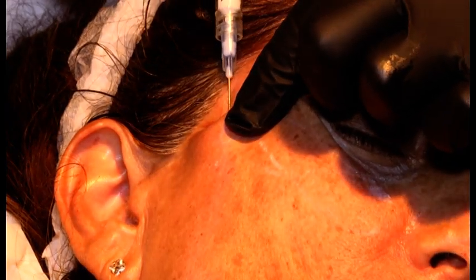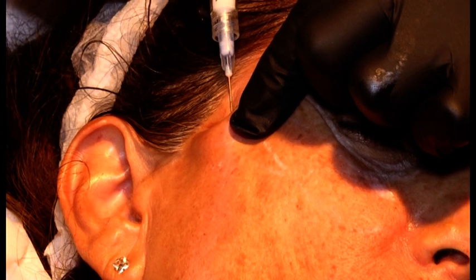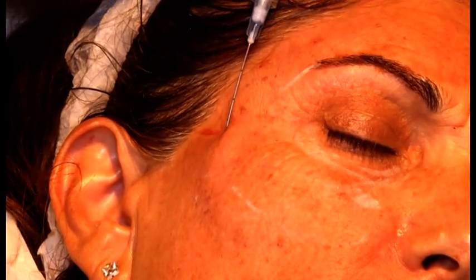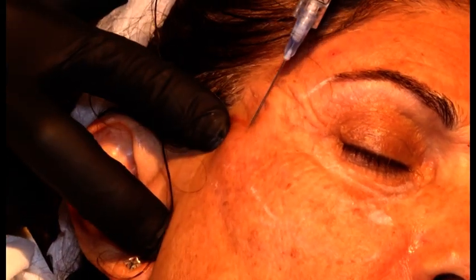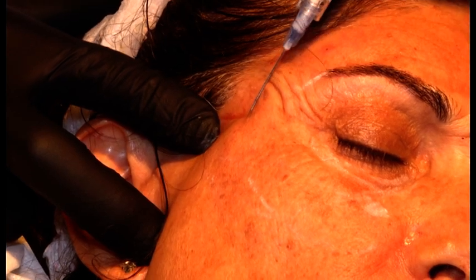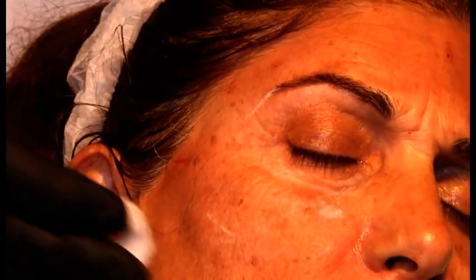Okay, and I wait. Over periosteum, feel resistance, click. Bolus, retrograde. I go further laterally. This is the area of the zygomatic retaining ligament. Click. Bolus, retrograde. Okay. Now I get to the molding part.